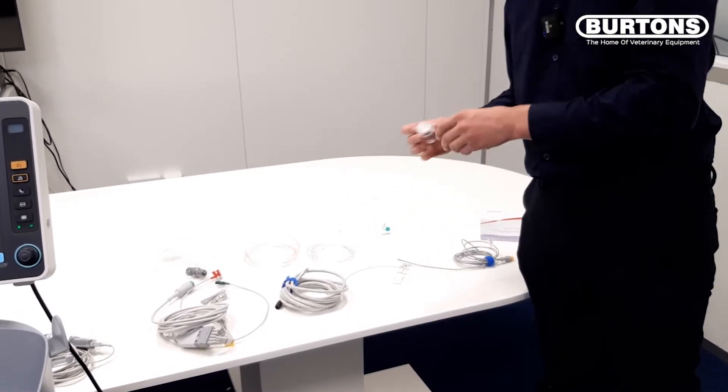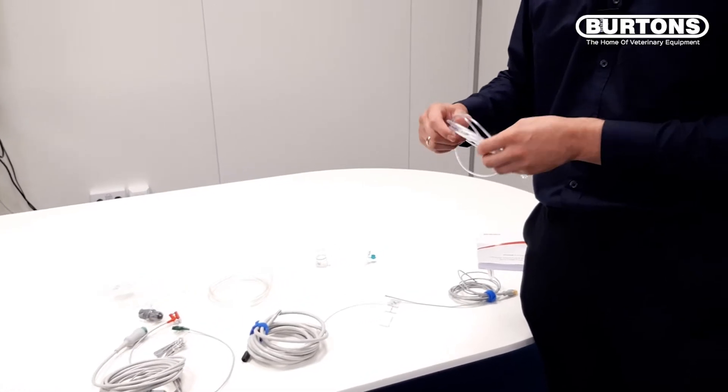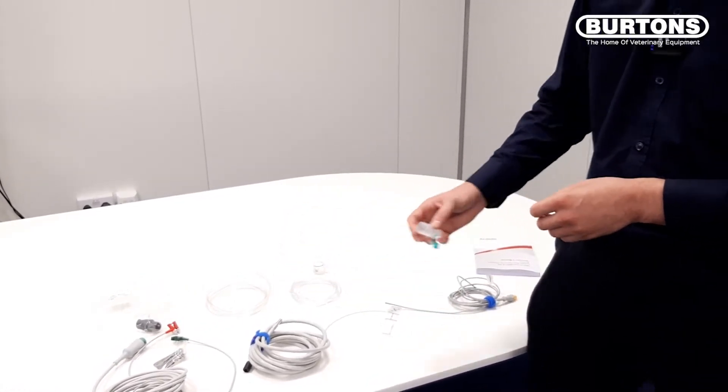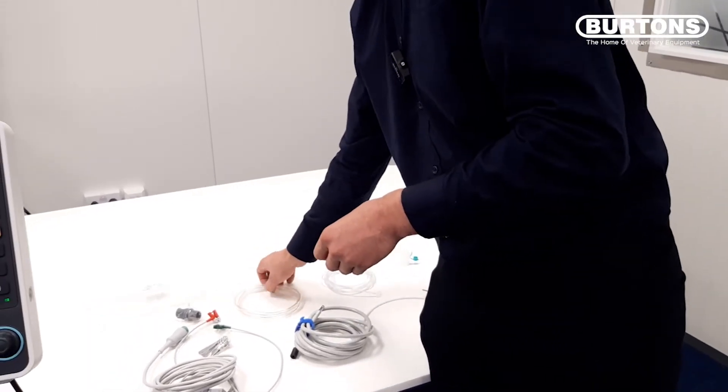Moving on, we have our water trap, which is complete with the sampling hose. We have our ET tube connector, and we also have our scavenging kit here as well.